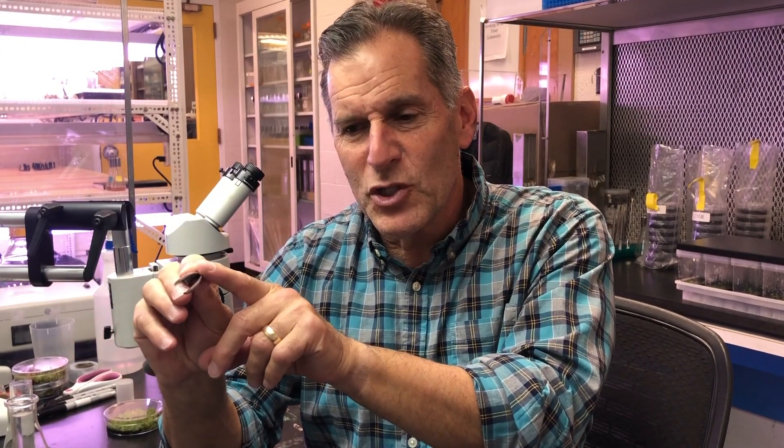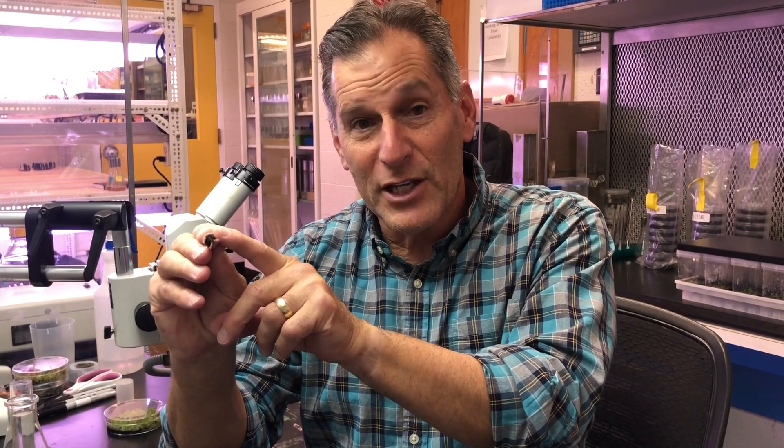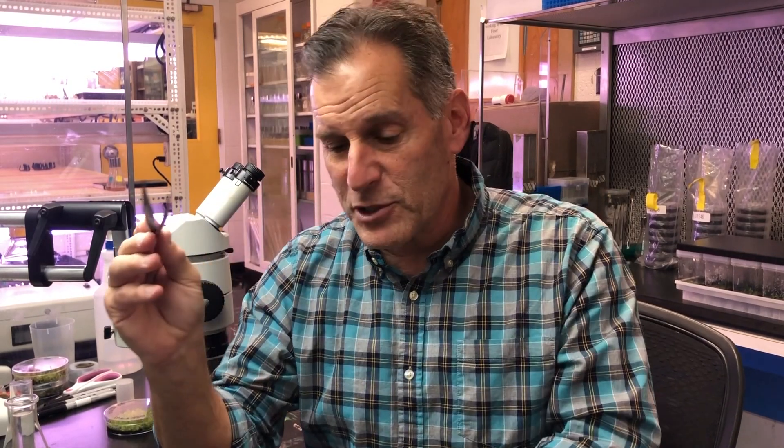All right, so now we have sterile instruments. Sometimes these are hot and we can let them cool down; sometimes you can use them right away. These are really fine instruments and I can get a really nice grip on my tissue with them. Sometimes I use two hands in order to get good control on the forceps. That's pretty much the basics.